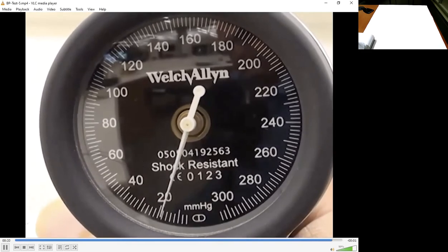All right, how many of you took your eyes off the prize there? That was kind of a different one, though. It was a little bit tricky, so let's see what happened here. Did you at least get the first sound? The first sound started around 150. It was pretty high, so it started about 150 and then disappeared at 136.